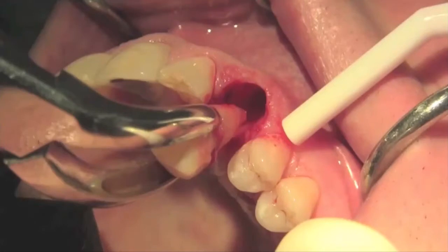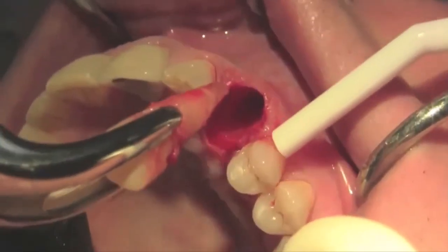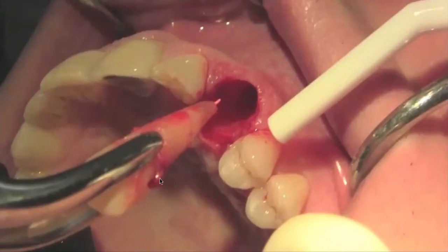You're going to be able to see over here the good aperture from the root canal done by the specialist, a little overfilled, but again, it was decided not to continue with the orthodontic treatment, and you can see part over here of the radicular resorption of the root, which was very big.